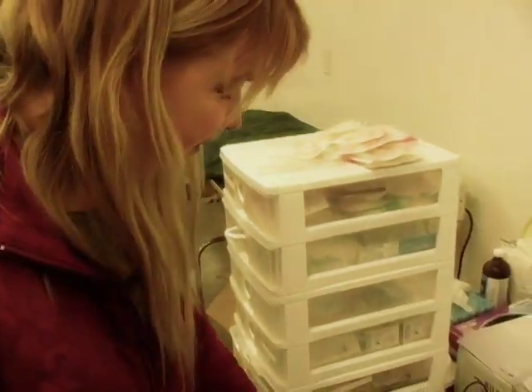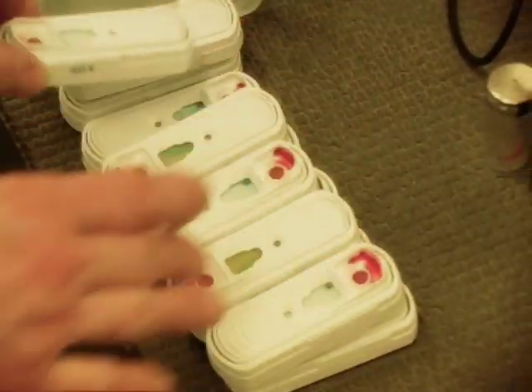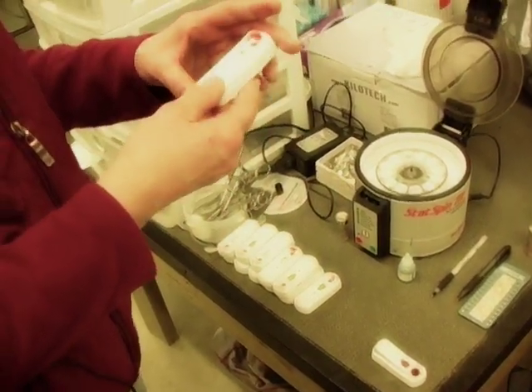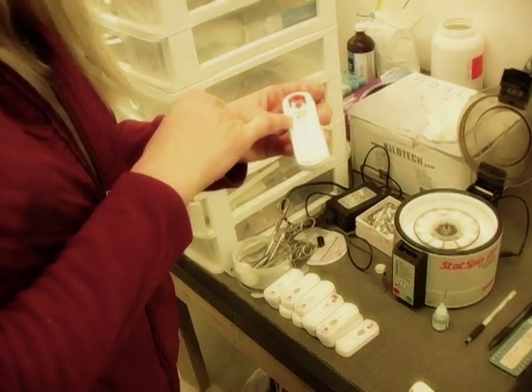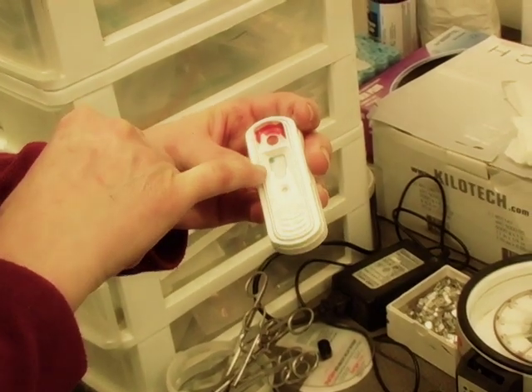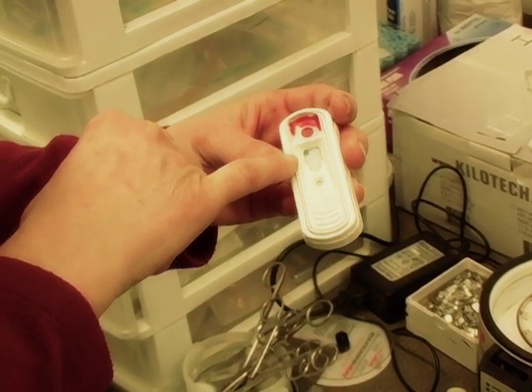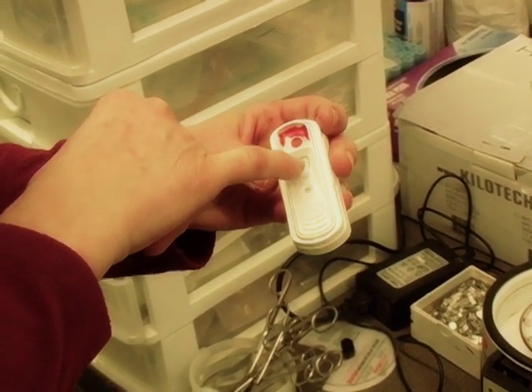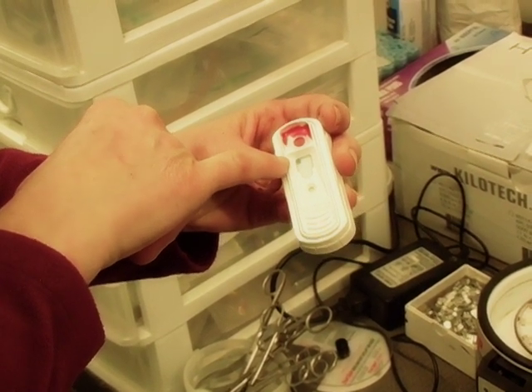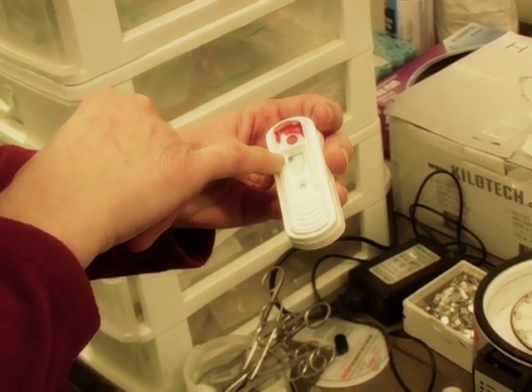We've done several tests today and we are seeing all negatives — that's great. The blue spot is a positive control. If we had any positives, we would see a blue circle in the corners and up top as well. But you can see that it's all negative.